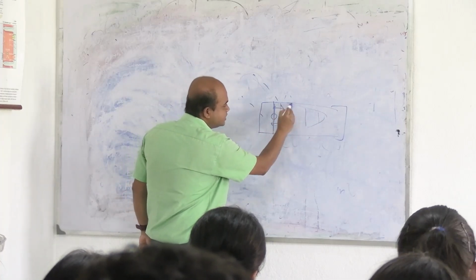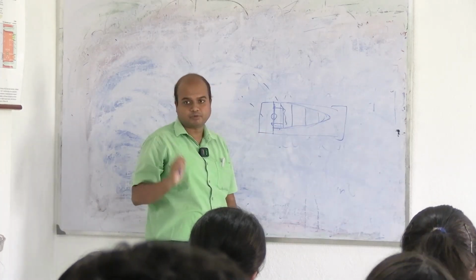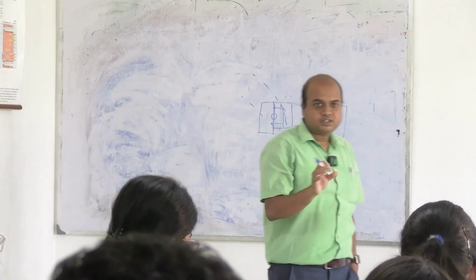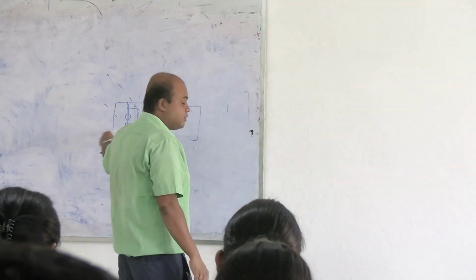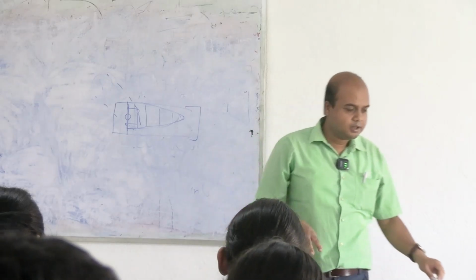An ideal smear becomes a tongue shaped smear. If it is a straight one also, you can work with that, but ideally it should be a tongue shaped smear.